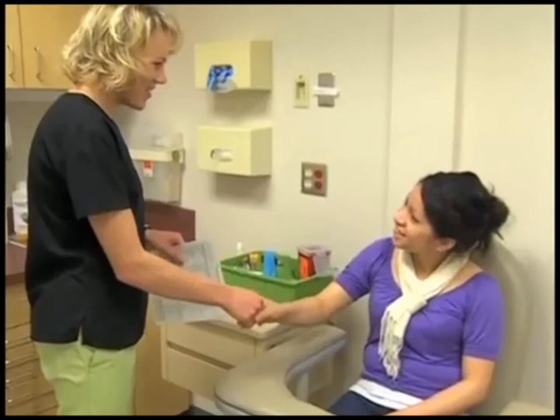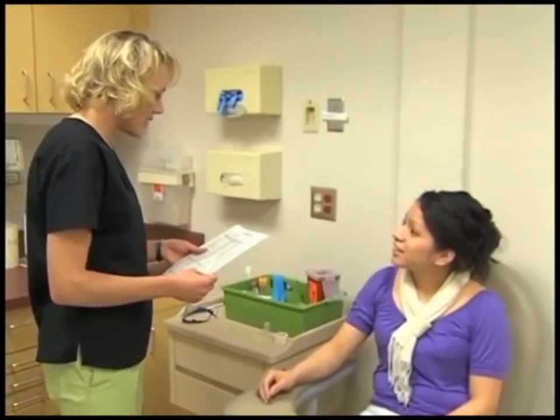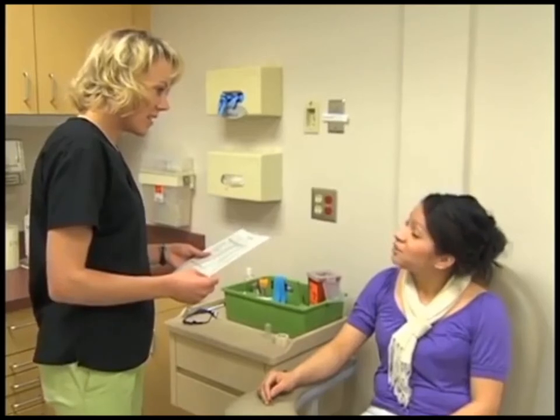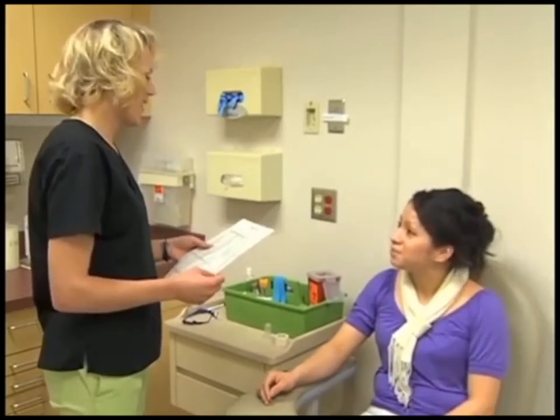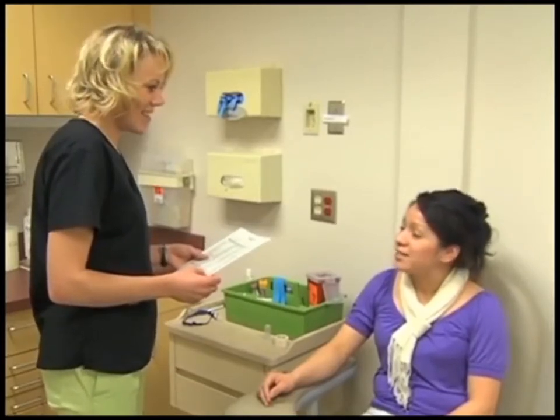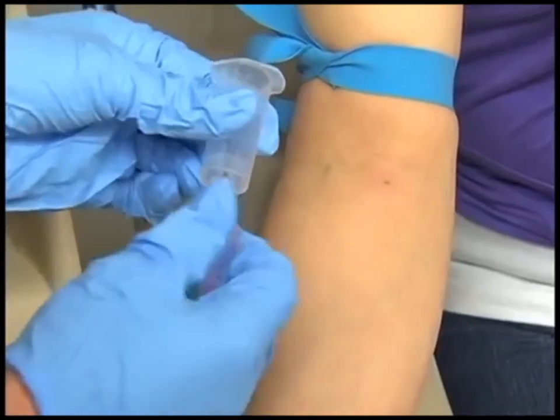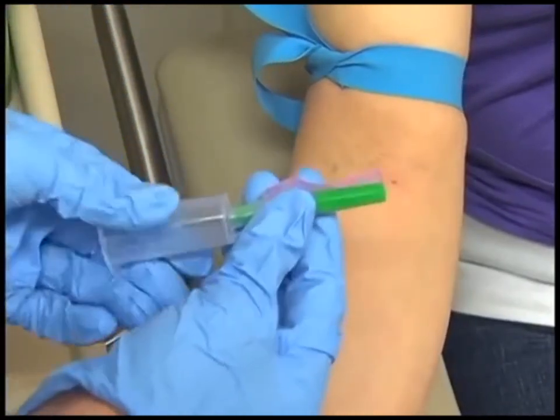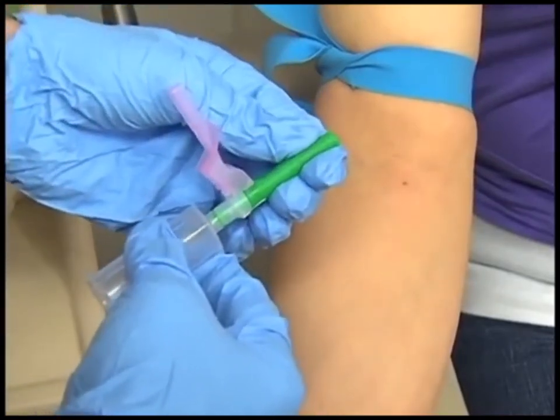Venipuncture is often a frightening experience for the patient. For many patients, the anticipation of the procedure is worse than the actual drawing of the blood. The medical assistant should take time to explain the procedure to the patient in an unhurried and confident manner. This helps to alleviate the patient's fears, which relaxes the patient's veins. Relaxed veins make venipuncture easier to perform and result in less pain for the patient.